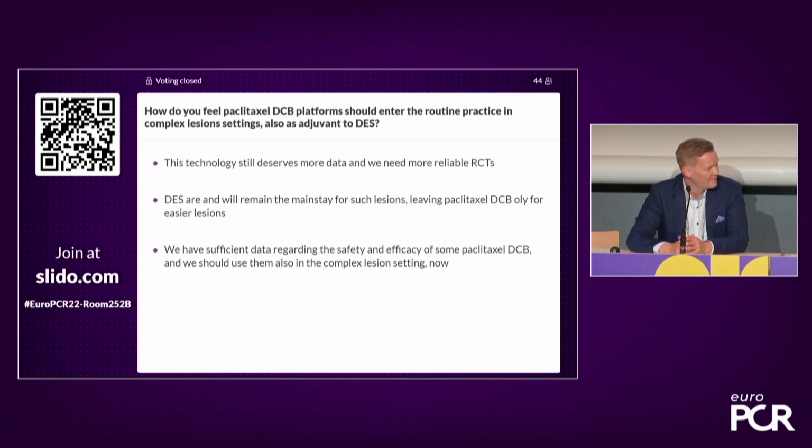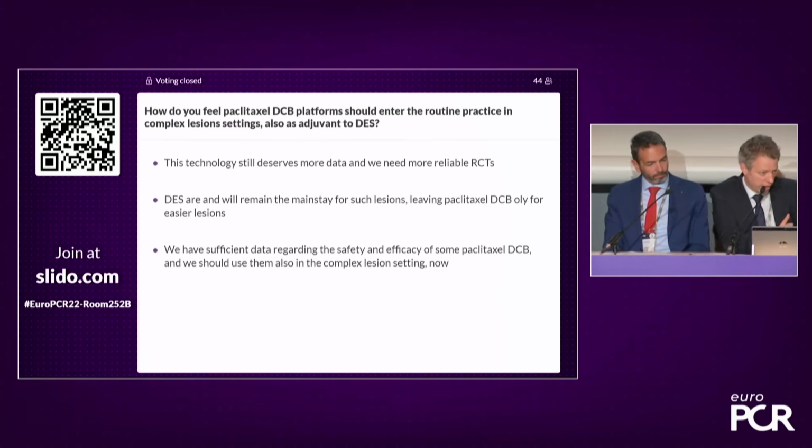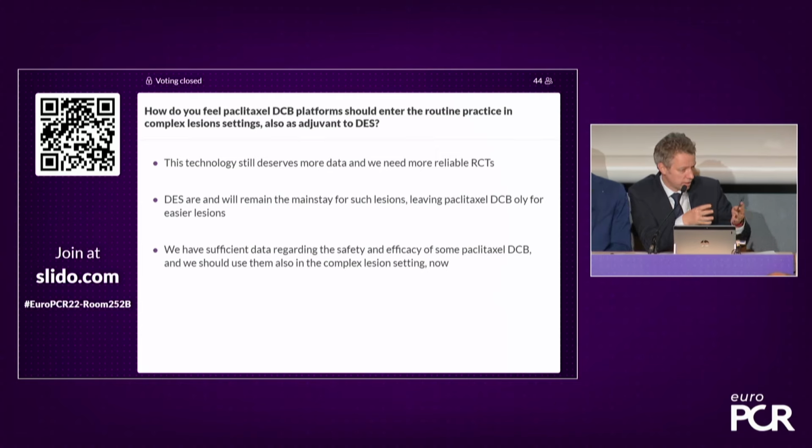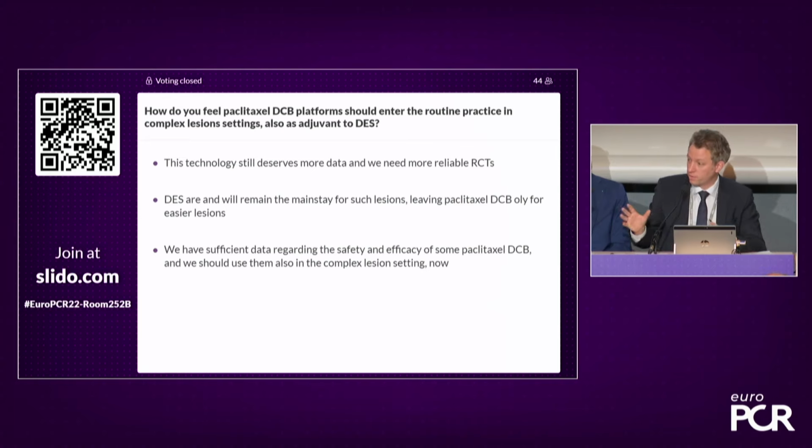Yeah, and I mean, there's a natural tension. One of the things that we tend to focus on is very much getting it right first time. And there's a tension between that and an investment procedure, which I suppose has a role in certain settings. Here, there was a clear, relatively long subintimal course you could see beautifully on the IVUS. And it was interesting to see how it evolved in follow-up.